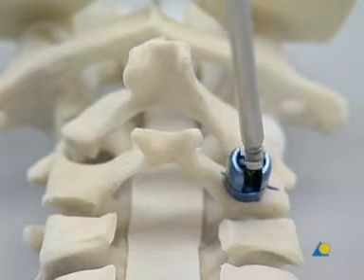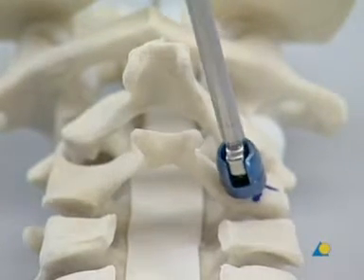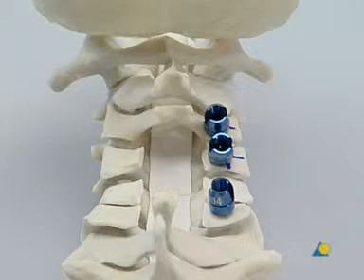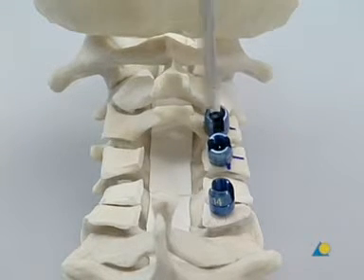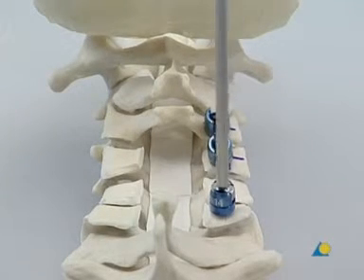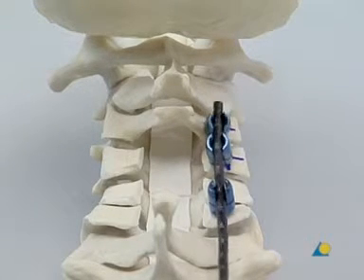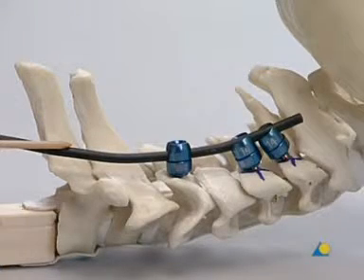The unrestricted movement of the variable axis head makes it easier to insert the rod. Once the screw is in place, the process is repeated at C4 and C6. The alignment tool may be used to help line up the variable axis heads in the correct position. The trial rod is used to determine the lordosis of the cervical spine segment that will be fused, as well as the length of the rod needed.